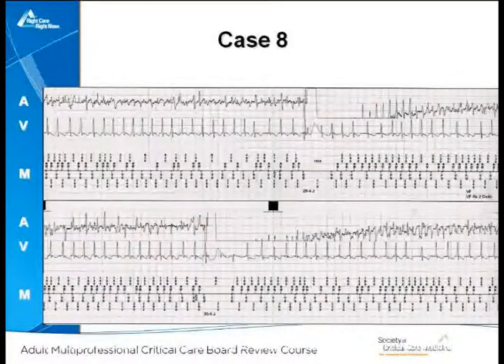So would you change his VF detection zone? Would you turn the ICD detection off? Would you turn the ICD detection off and transfer him to the ICU? Would you add anti-tachycardia pacing? Or would you just continue routine care?